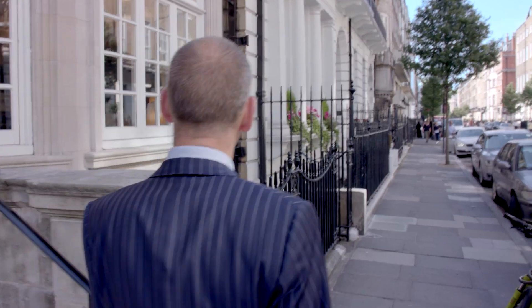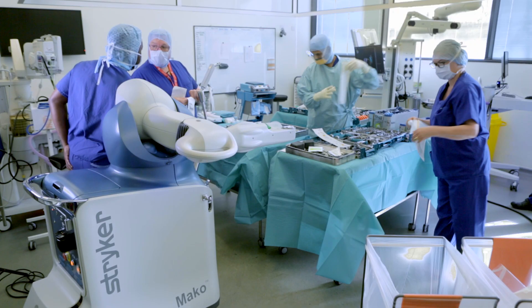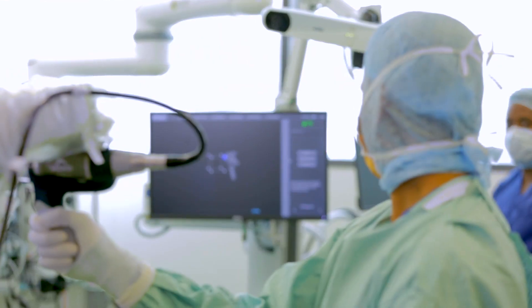The traditional method of performing knee replacement is to make cuts based upon what one imagines the alignment should be, but often one doesn't have absolute precise knowledge of that. Today we're going to look at a robotically assisted knee replacement using the Mako robot — a tool which helps me both plan and execute the knee replacement with a great degree of accuracy.